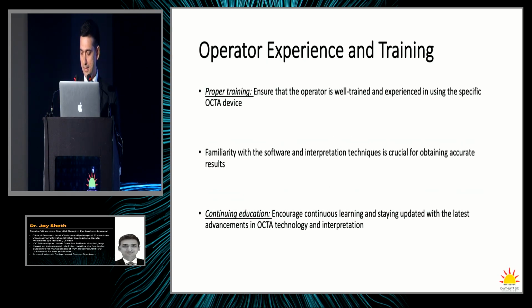And last but not the least, as they say, it is not the machine, but the man behind the machine. So the operator has to be adequately trained to acquire the best quality images, and they should be familiar with the hardware as well as the software of the machine, and continuous education of the operators is also needed.